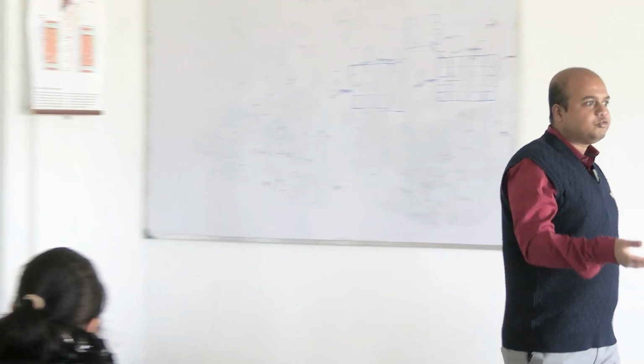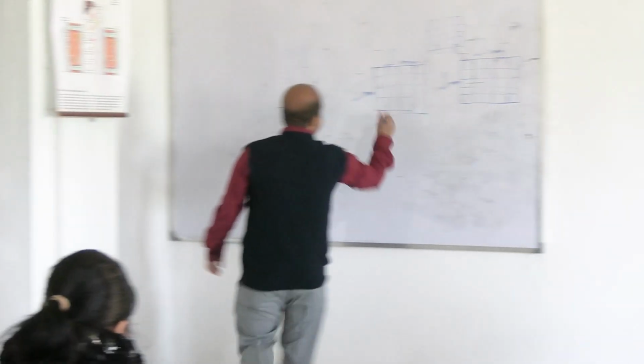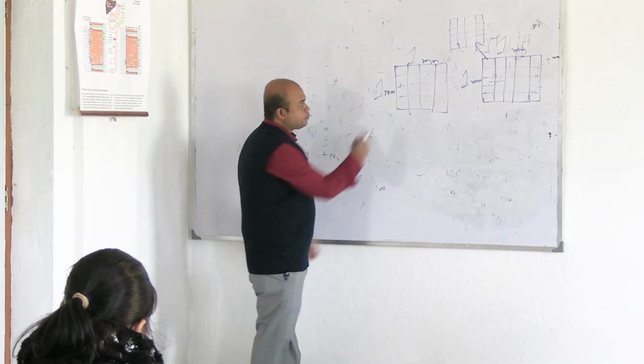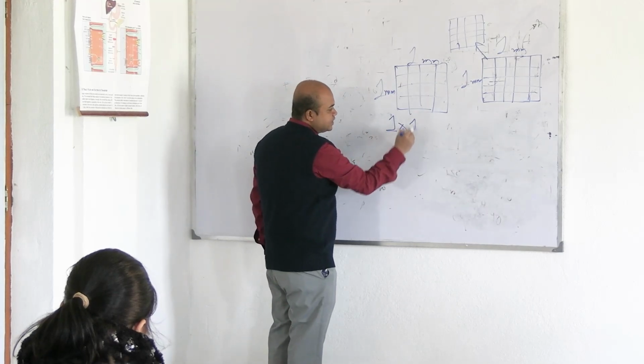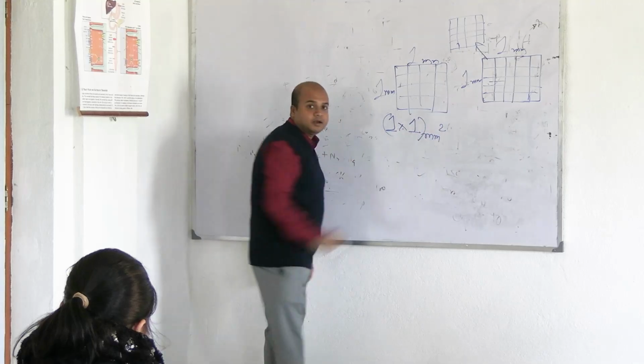Think of it that way. If we have not diluted the blood, then whatever figures we are getting would be 50x, or in the case of WBC, what is the calculation? 4 such squares are counted. So each square is this area, each square millimeter.